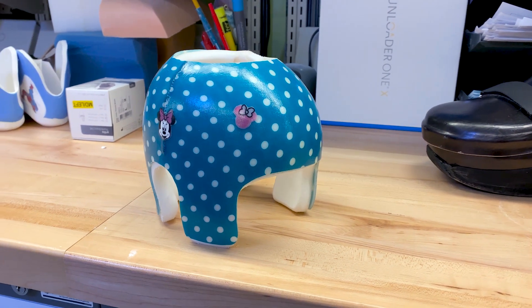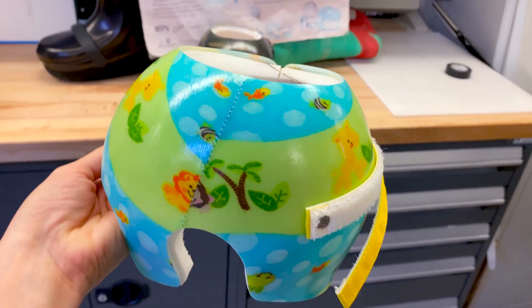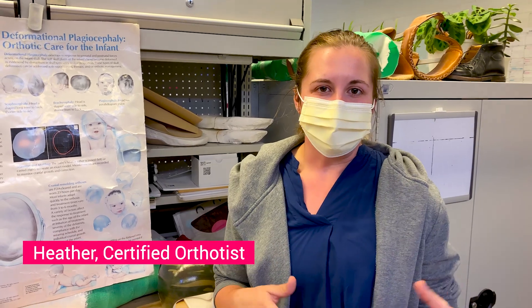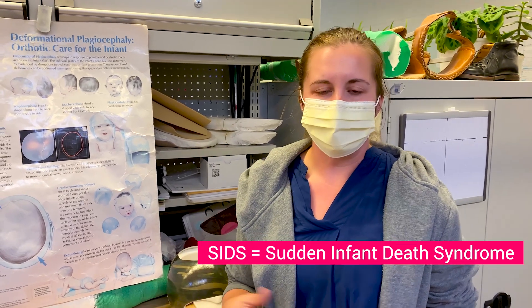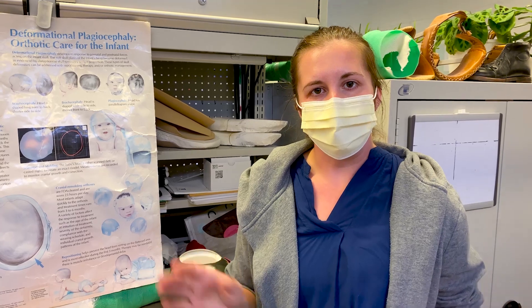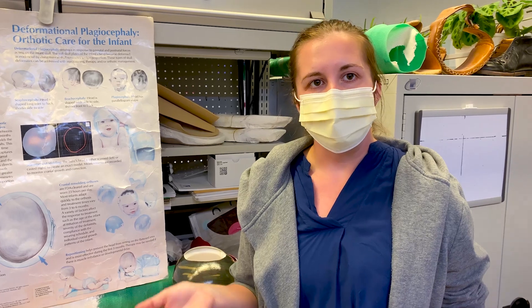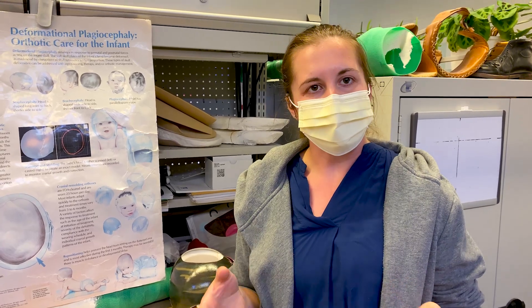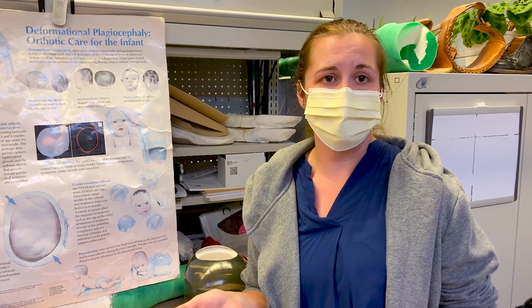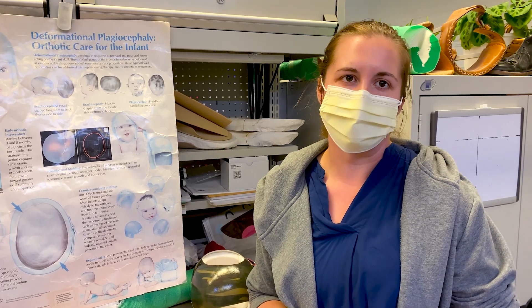On to something completely different: cranial molding orthoses, or helmets, designed to correct the shape of a baby's head. Back in the day there were a lot of incidents of SIDS, but in the 90s they started a back-to-sleep program that almost eliminated it. Now that babies spend more time in sleep sacks, car seats, and strollers, those with bigger heads or who are sound sleepers tend to get flat spots from being in one position. If it gets too flat and they can't roll out of it, we often put a helmet on to try to get it rounder.